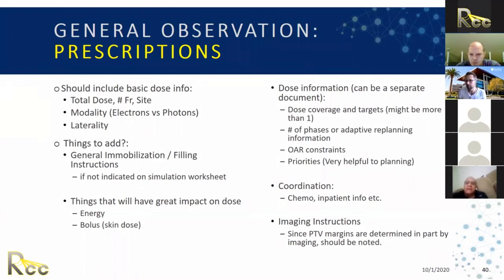Again, we have a lot of different ways to immobilize a patient, and a lot of different ways to image a patient. So it's important for us to tell the therapists, for this particular patient, do this type of imaging. For this patient, do a different type of imaging.